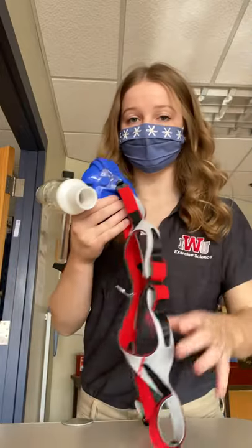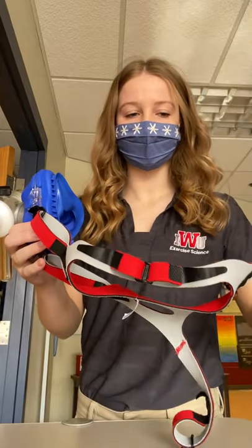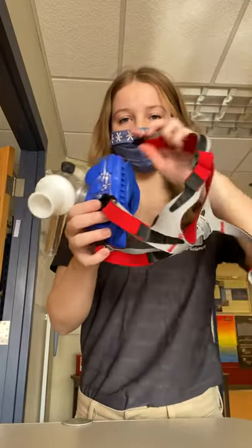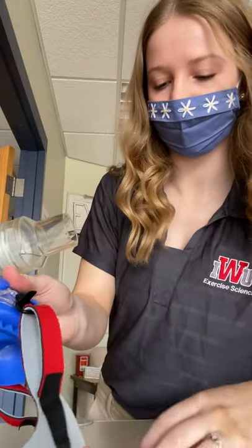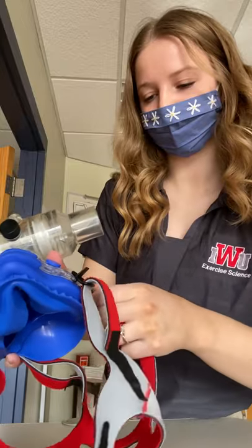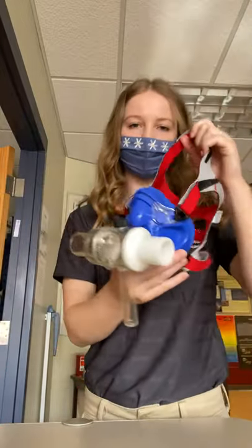When you have your participant, you'll have them hold their mask on their face. Then you can wrap the head strap around their head and do the same steps on the other side. And that is how you assemble a VO2 mask.